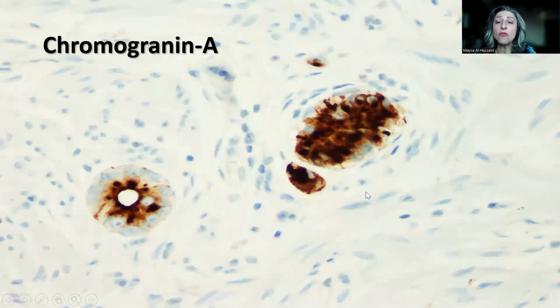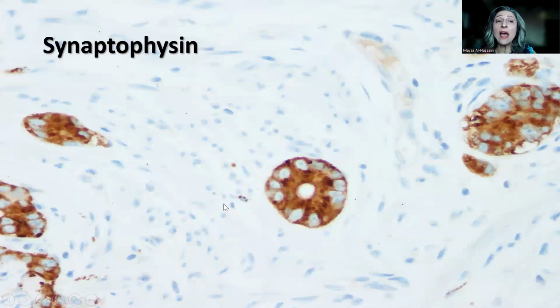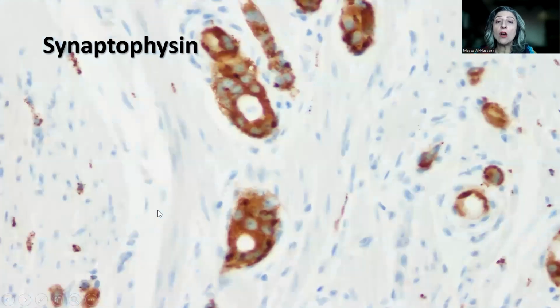And this is another focus where we have the glandular formation, very nice gland, and then we have the chromogranin positivity. And of course, we always have to supplement with another neuroendocrine marker. Synaptophysin is the second neuroendocrine marker, and again, strong diffuse positivity in the glands or tubules infiltrating the wall of the appendix, and this is another focus.